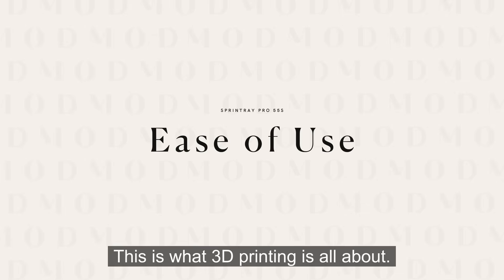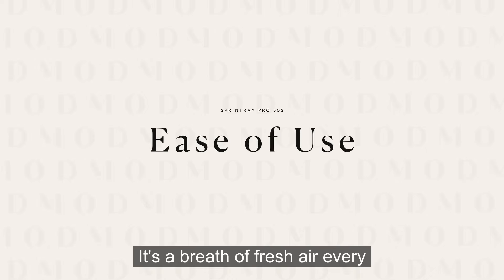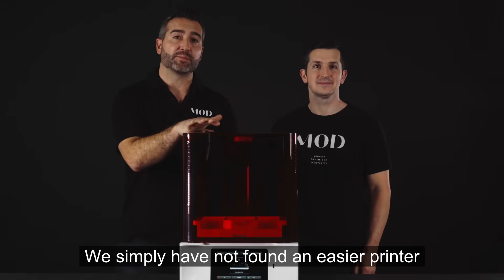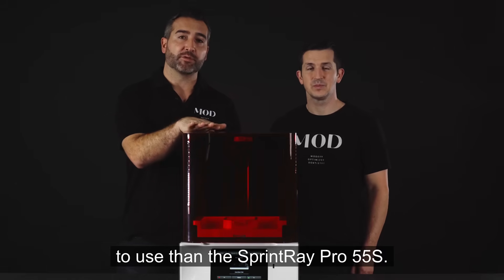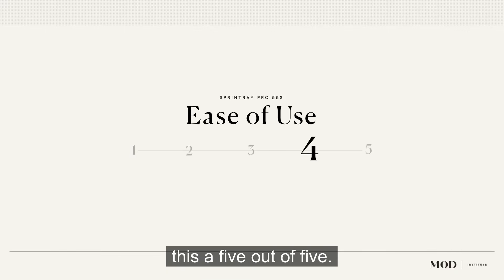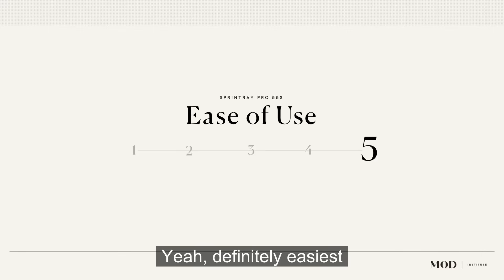This is what 3D printing is all about. It's a breath of fresh air every time we print on this. We simply have not found an easier printer to use than the Sprintray Pro 55S. We're going to have to rank this a five out of five — definitely the easiest to use on the market.